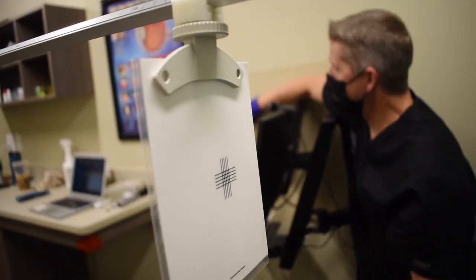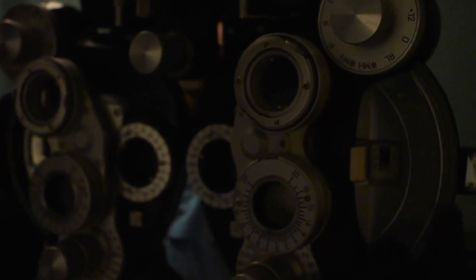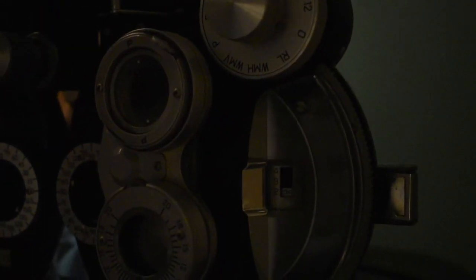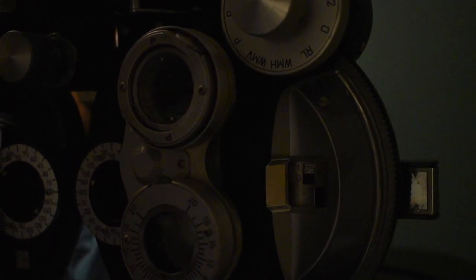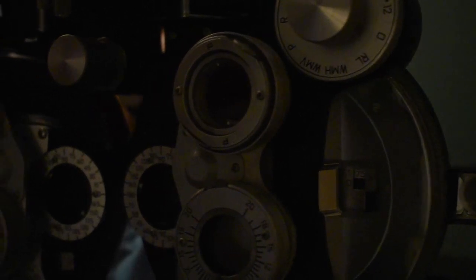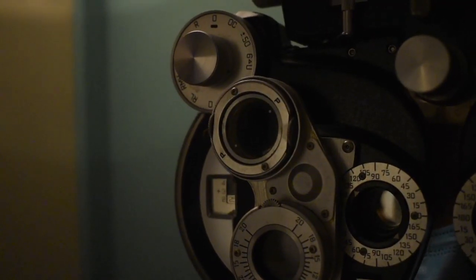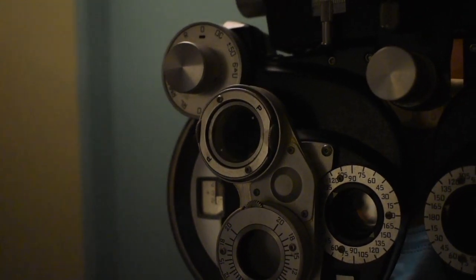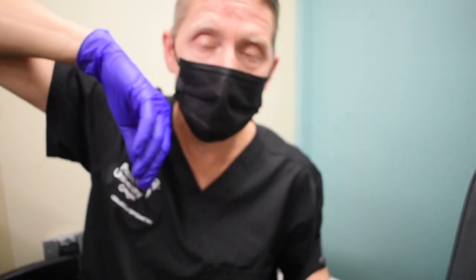I'm going to turn off my lights. I'm going to ask my patient which set of lines are darker and more distinct, vertical or horizontal. Vertical. And now? Vertical. Vertical. Vertical. Vertical. Horizontal. Great. So right here we have a plus 150 for our patient. Take the cross cylinders out. You can check visual acuities at that point. But here you've been given 2 different methods to come up with a tentative add power for that patient.